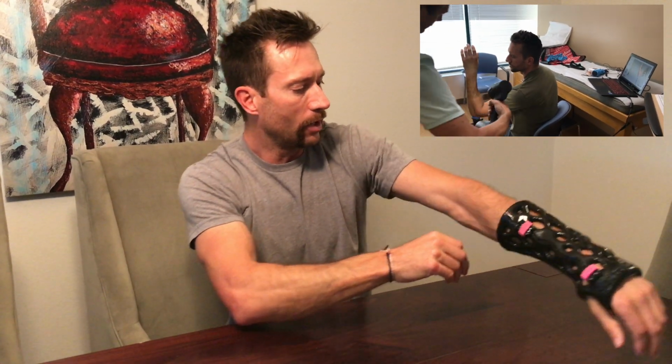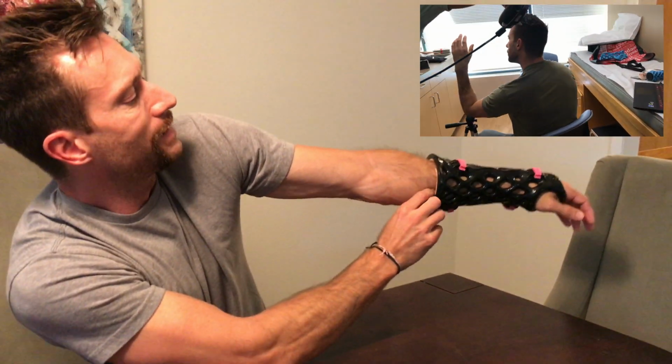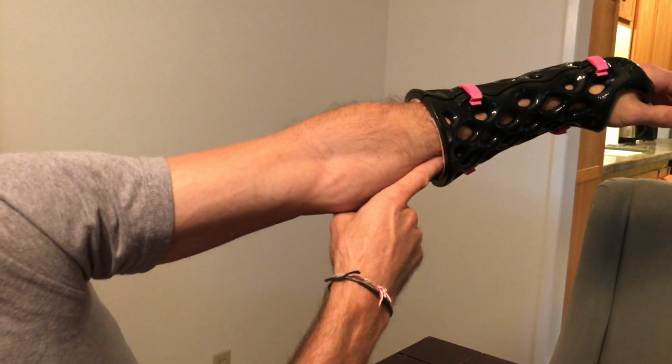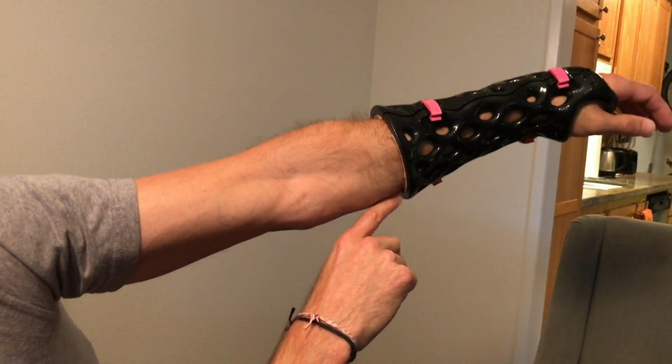So you can see when I go like this, there's space in there. I don't know if you can see that, but I can get my finger in there, and it creates that space, and that's a little disconcerting when you first get fit for the cast. But again, I just cut a couple strips of moleskin, and it really helps take up that volume. At the end of the day, the biggest thing is it's healing well.